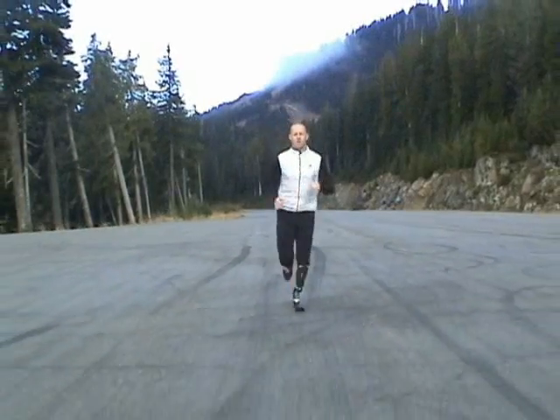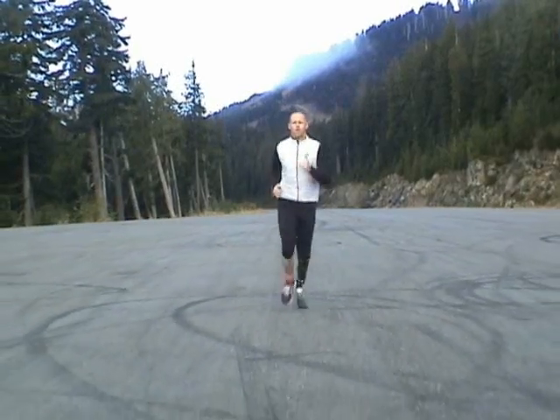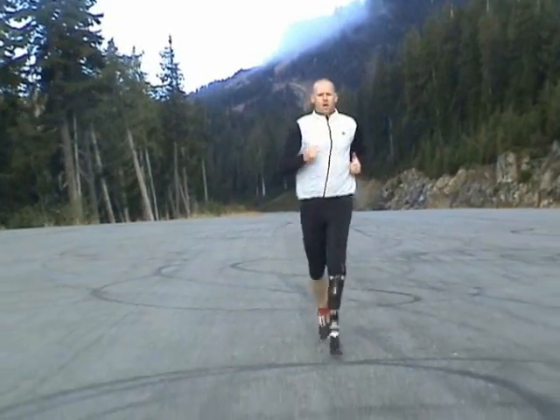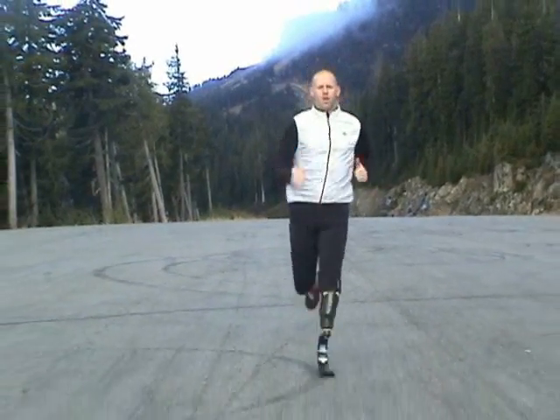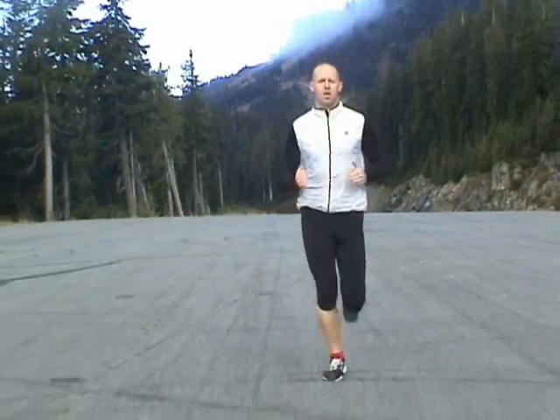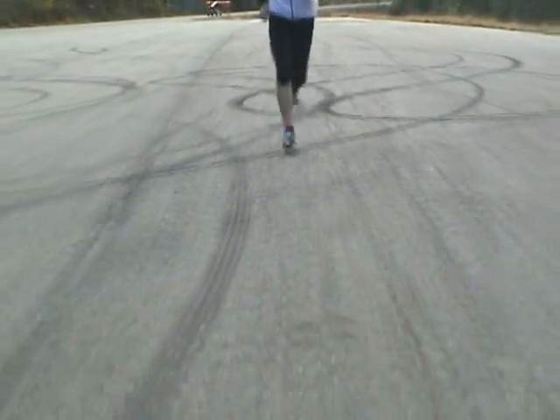It does not absorb impact nearly as well, and so as you run longer and longer, that impact begins to take its toll on your skin and your body, and you get more tired, you get painful areas within your residual limb, and things start to go downhill fast. Also, there's not nearly as much energy return, so you have to work a lot harder to go the same speed. You're getting something back, but just not nearly as much. And so it's quite inefficient to run with compared to the other one.